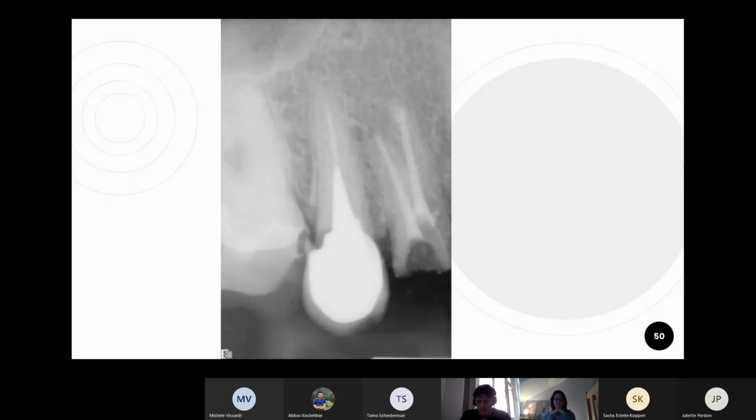Only 2 more, guys, and then we have it. Okay, one moment. Yeah, there's not much to see here, so I'm just going to go ahead and say it. So it's a periapical projection again. Always mention that. I'm not 100% sure, I think it's 1-5, and it's endodontically treated.